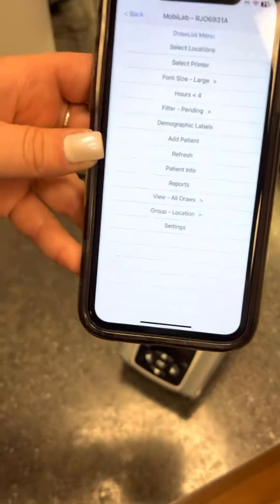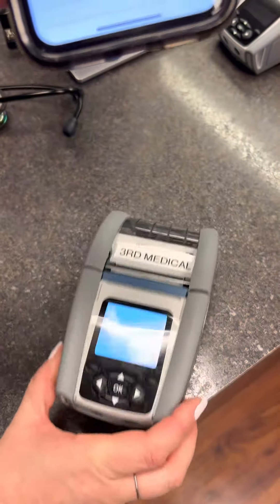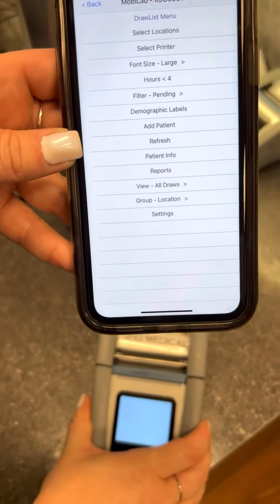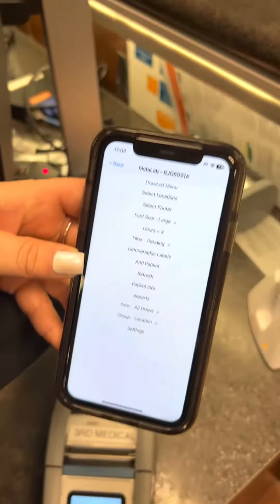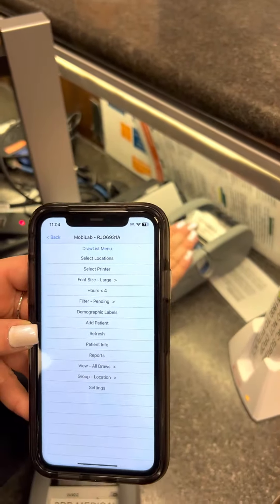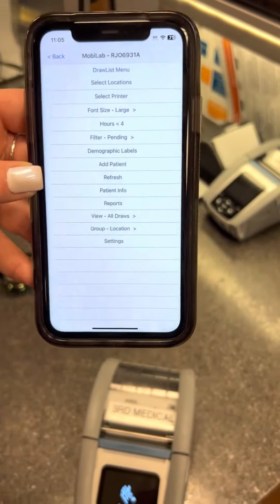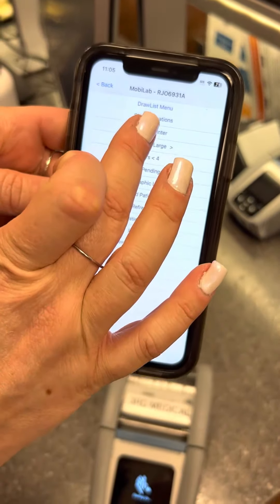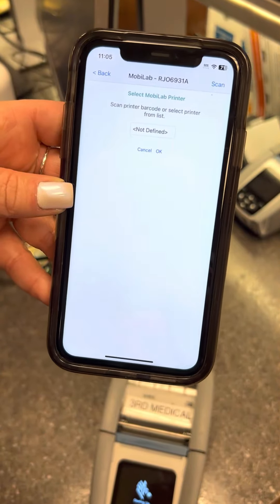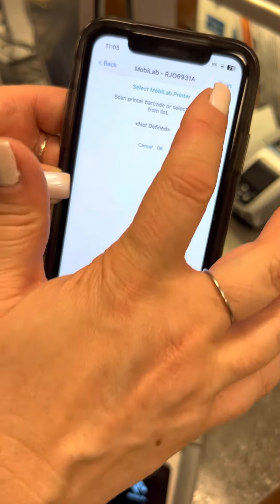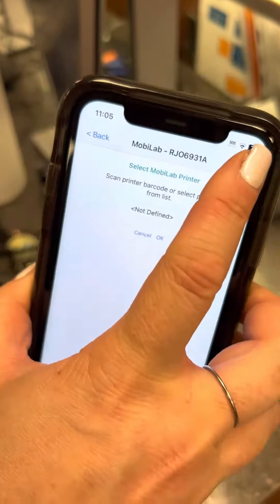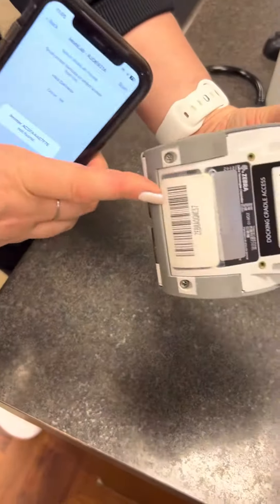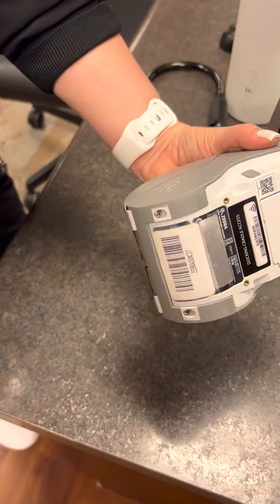To get the printer set up, first of all you need to turn on your device. If the battery is dead, we have spare batteries over here charging, and we have a second one here. Turn on your printer, then hit select printer, and then hit scan.